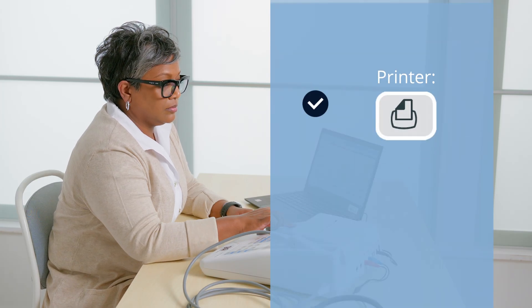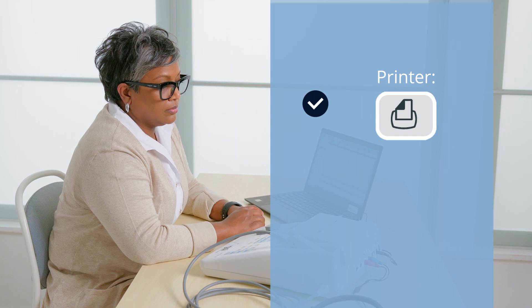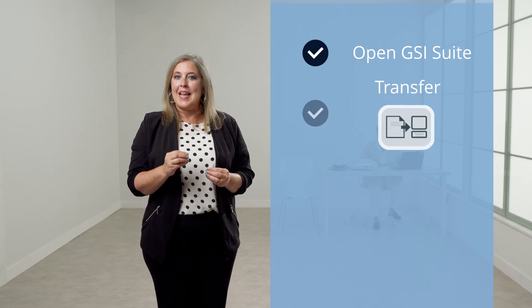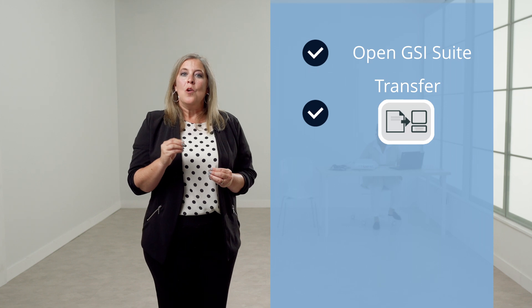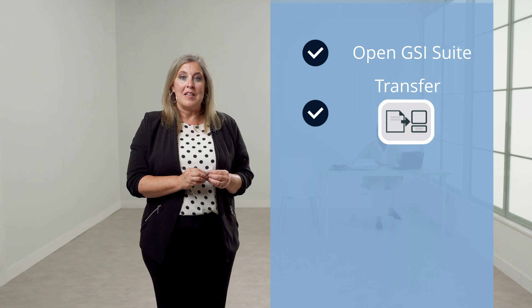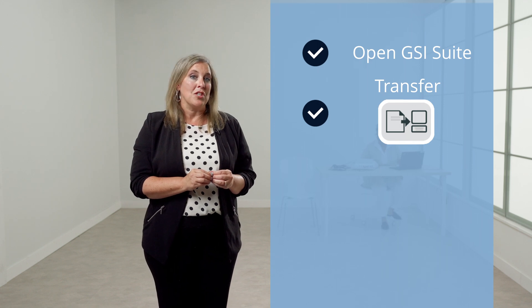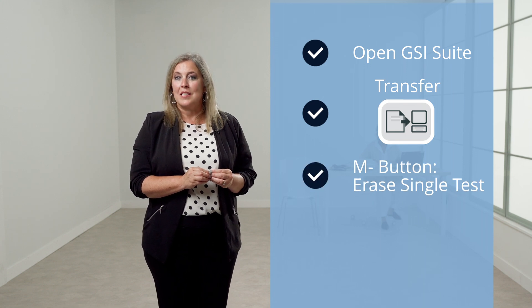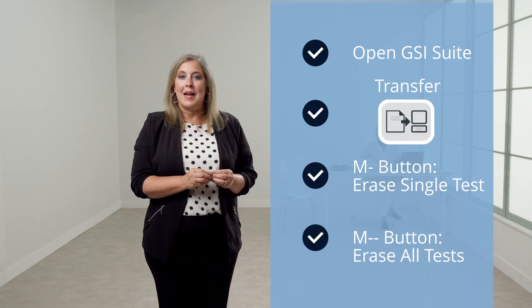To print the current test results with the onboard printer, select the printer button. To print every test stored in memory, press the print all button. It is also possible to transfer the data to GSI Suite for electronic data management. Open GSI Suite, select the tympanometry tab, then press the data transfer button on the GSI 39. When the data is printed or transferred, it is important to clear the memory of the GSI 39 to avoid mixing up patient results. To erase a single test, press the M minus button. To erase all tests from the memory, press the M minus minus button.